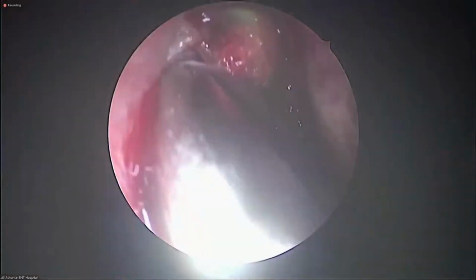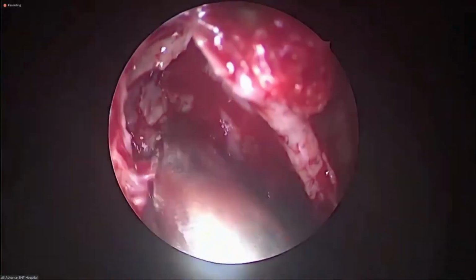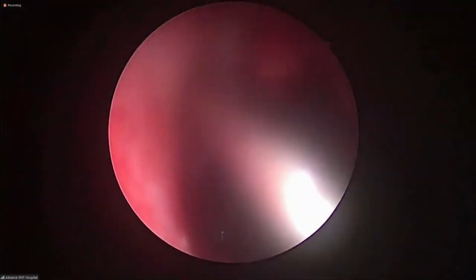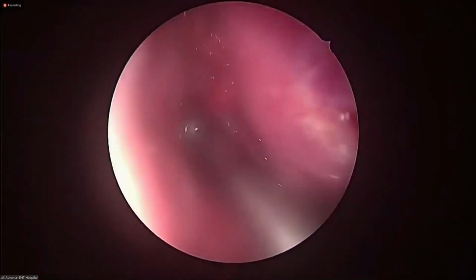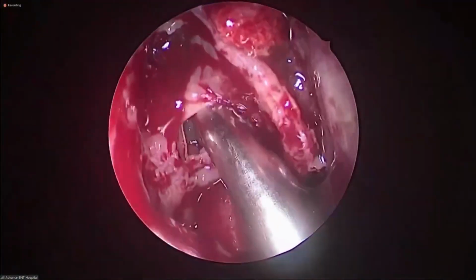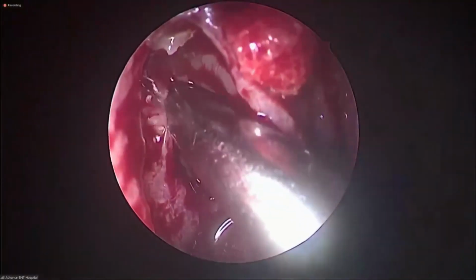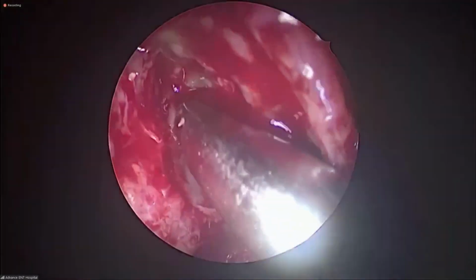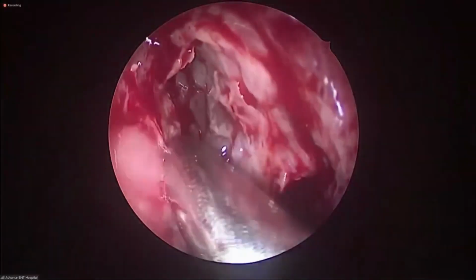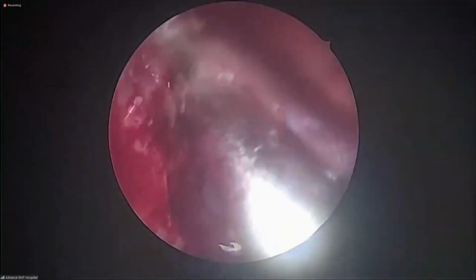See what it is? Clearing the level of axilla, of the lamina papyracea. Yes, sir. Laterally lamina is cleared. That is the level of the lamina papyracea. Let me clear it better. Yes, sir. That is your lamina papyracea. Can you see here? Yes, sir. Very clear, sir. Except some bleeding.